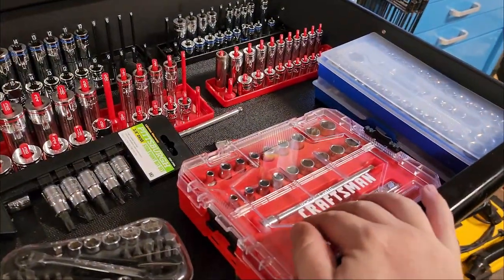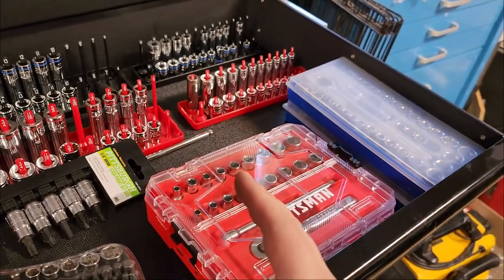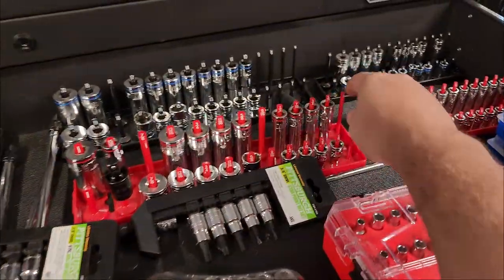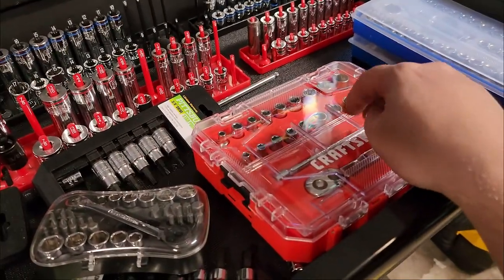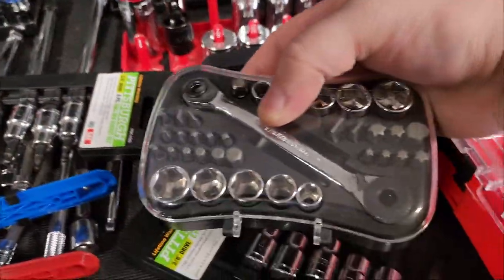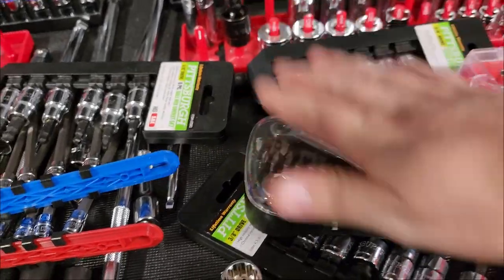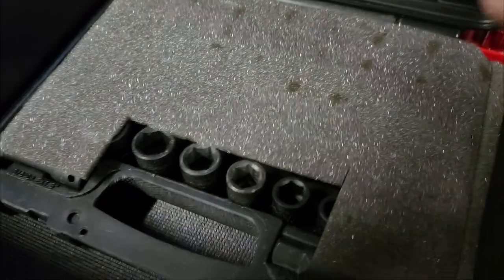Sockets often come in sets — I've got standard sets, metric sets, and compact sets great for grabbing and going on a job. The Milwaukee set is what I use every day because it interfaces with my Pack-Out storage system. I've also got a Craftsman set I've used for years, plus mini ratchets and a double-ended ratchet that uses many of the same bits.